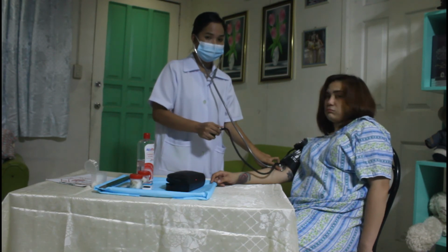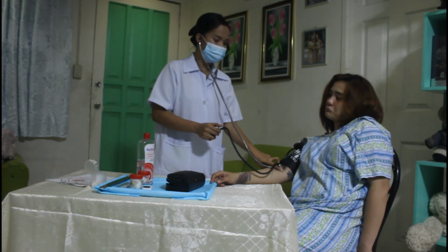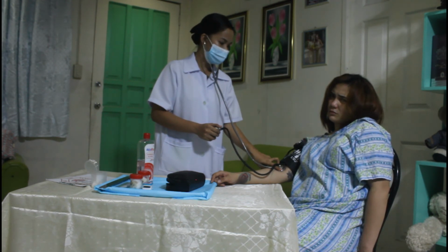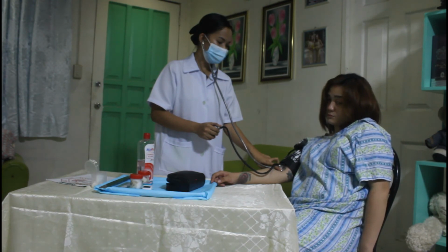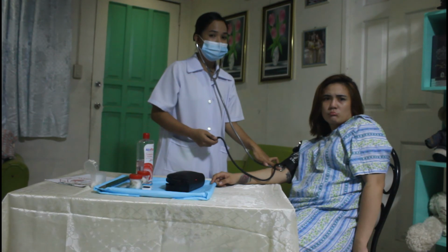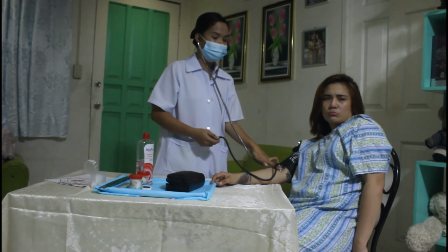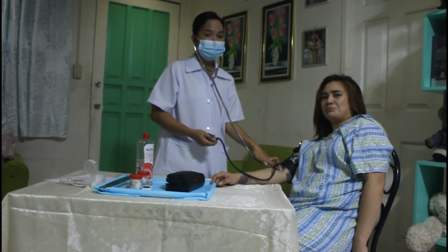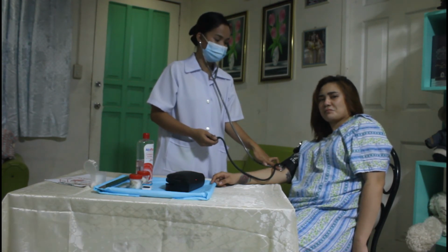Then quickly inflate cuff to 30 mmHg above patient's usual systolic pressure. So, note point on manometer when you hear first clear sound. So, first sounds reflect the systolic blood pressure.